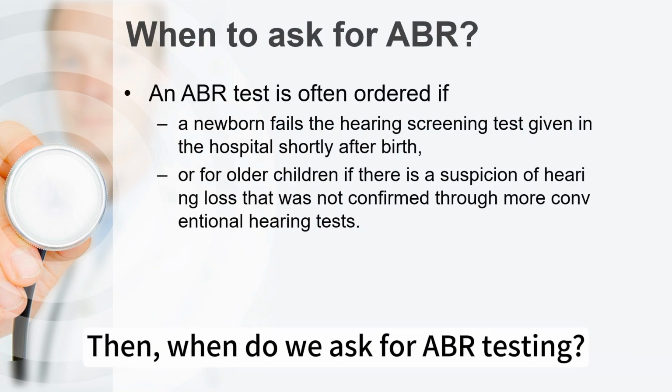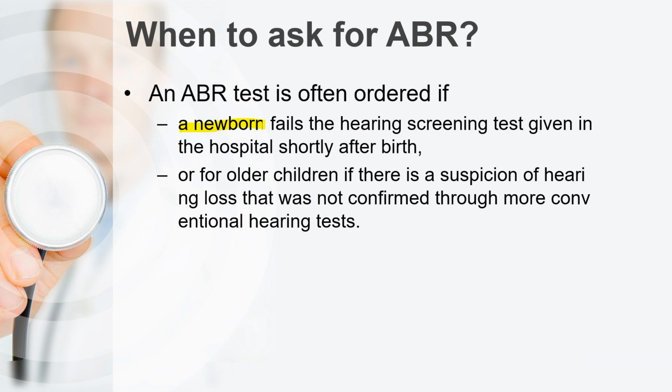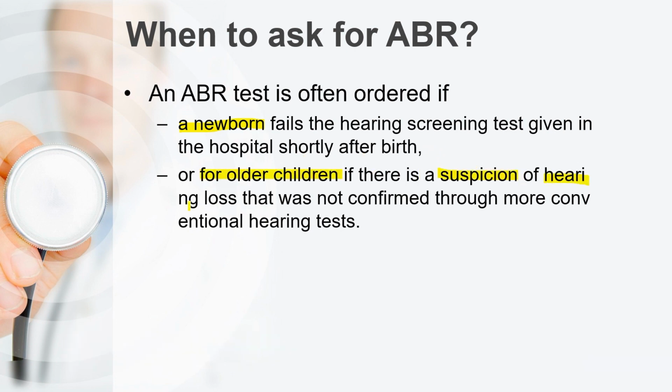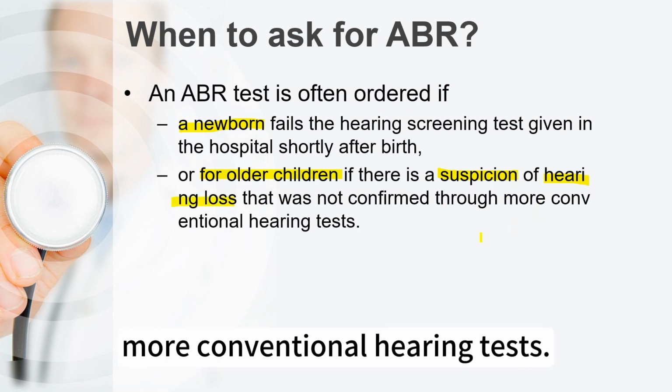Then when do we ask for ABR testing? ABR testing is often ordered if a newborn fails the hearing screening given in hospital shortly after birth, or for older children if there's a suspicion of hearing loss that was not confirmed through more conventional hearing tests.